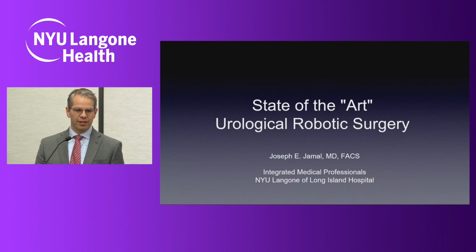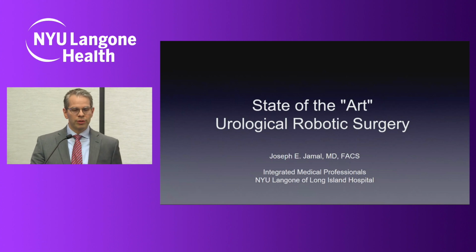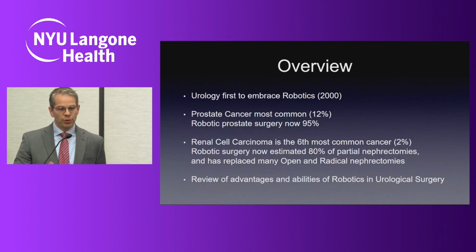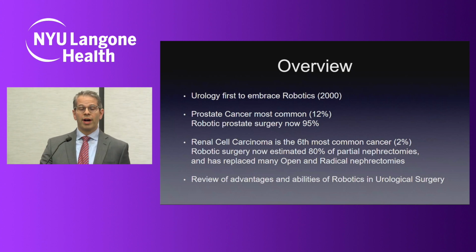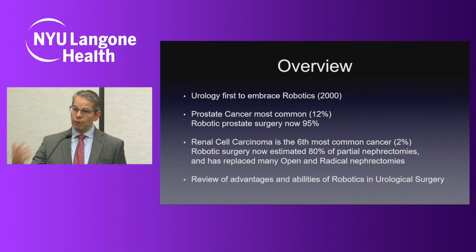This is a talk about the next generation of what we're trying to do with robotics, and so I've entitled it The State of the Art of Urologic Robotic Surgery. Urology was actually one of the first specialties to embrace robotics. The first prostatectomy, where we removed the prostate, was done in 2000 by Dr. Menon in Detroit. Initially, the robot was thought to be used for cardiac surgery, and the ergonomics weren't good for it. So urology really embraced it for pelvic surgery with the first 3-arm robot, and that robot has become much more robust as it has evolved.